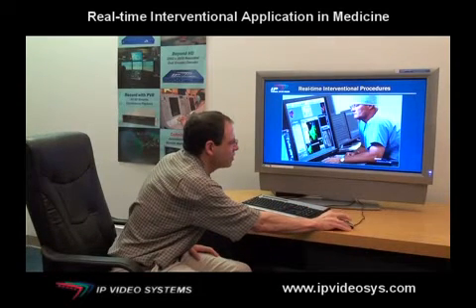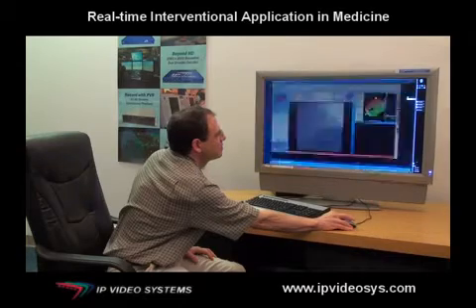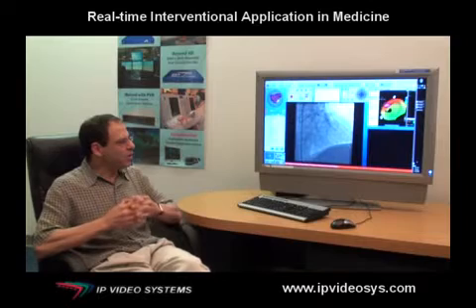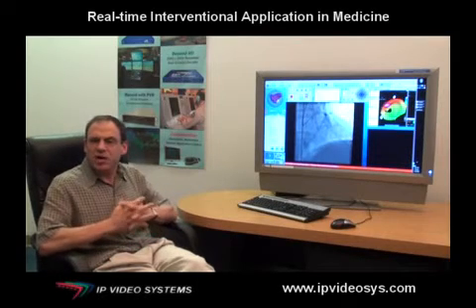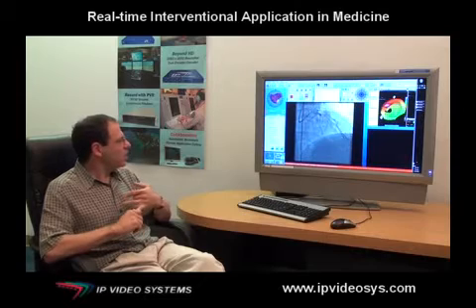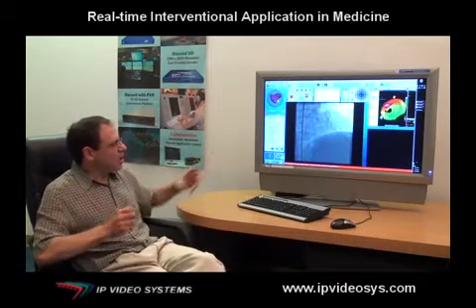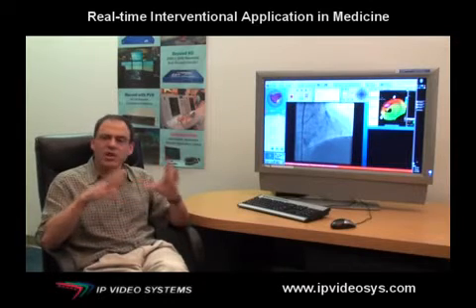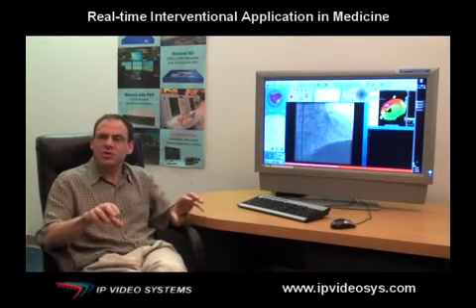Here is actual surgical data that we've captured with our systems. What you see in front of you is the kind of complex real-time interventional procedures that are absolutely essential in a modern medical environment. The main image is an x-ray image of a catheter actually moving through the patient's arteries near his heart. All around — and I'm not a physician — you can see other data including cardio, live fluoro, an ECG, blood pressure, and so on. All of these windows are combined into one single HD display, and what our hardware and software is able to do is capture that full HD display, compress it, and send it out over a global network so that anybody in the world can view this physician's real-time procedure as he's actually doing it.